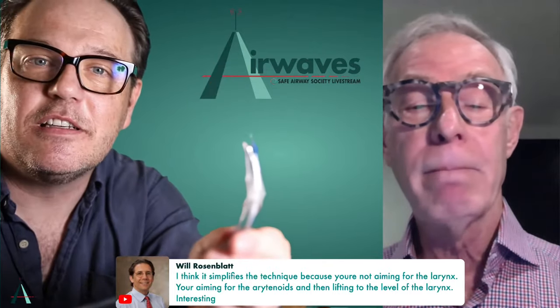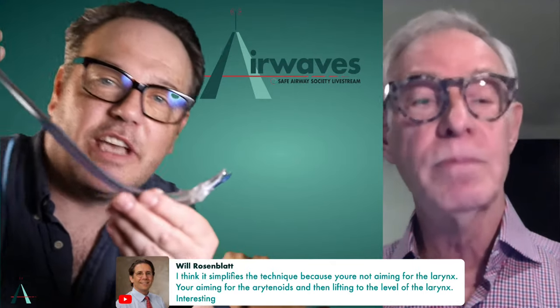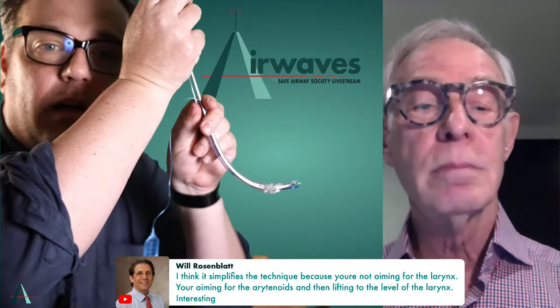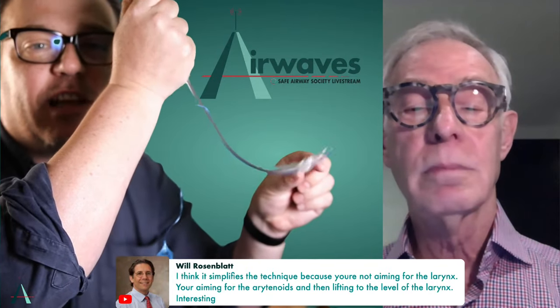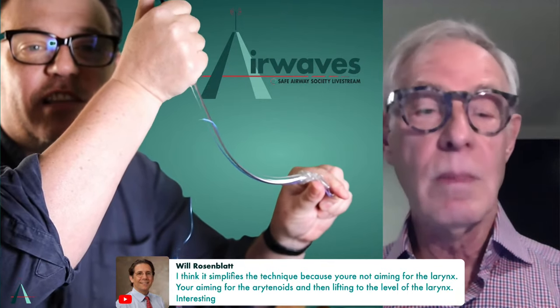And I think it's also important to mention that the tip of the stylet should not protrude beyond the endotracheal tube. So I'll just try and show that there, that's not very well focused, but you can see the stylet's inside the end of the tube. And then as you're getting to the cords, you're really only putting sort of that far between the cords, aren't you? And then I start to shuffle that back so that this gets the flexibility to do that downward turn along the axis of the trachea.